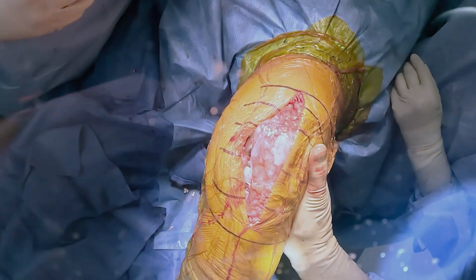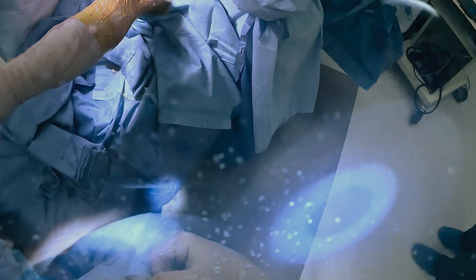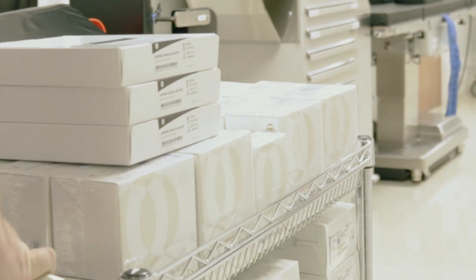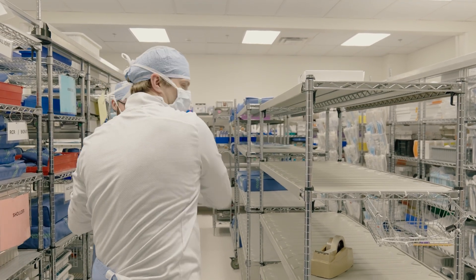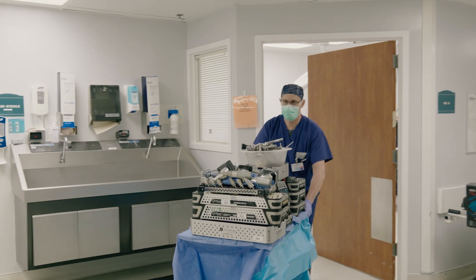I feel extremely confident with this technology. It gives me accurate and reproducible results that have translated to improved patient care, and I couldn't be happier with the outcomes we've seen so far. The beauty of OrthoAlign is that in a surgery center, even though your partners might use one implant and you use a different one, you can still use it on all patients because it's an open platform. It allows you to hit that target you're looking for, whether it's a mechanically aligned knee versus a kinematic knee, reliably as well as accurately. It is a very small footprint — we only need one tray compared to multiple — with a minimal amount of disposables. This allows it to run efficiently as well as helps the SPD throughout the whole process.